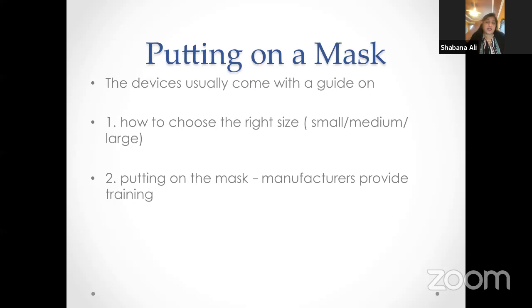So as Dr. Mohsin mentioned, all these masks and how the CPAP machine works comes as a guide. As of now, we are not sure. There are so many devices, so many machines in the market. But the important thing is how to choose the right size of the mask, which is very, very important. You cannot put a very small mask on a very big facial area, which is not going to serve the purpose. And then again, you have to follow the manufacturer's guide on how to pick the proper mask.